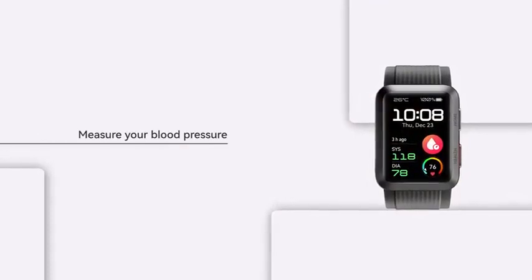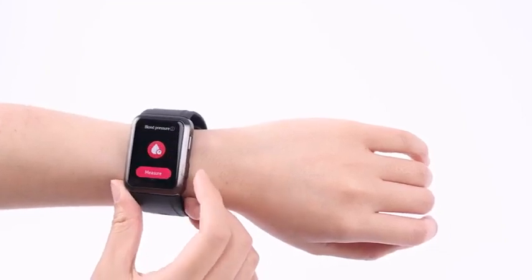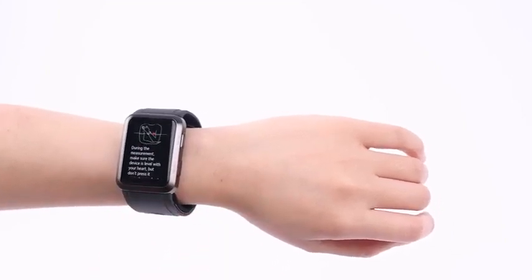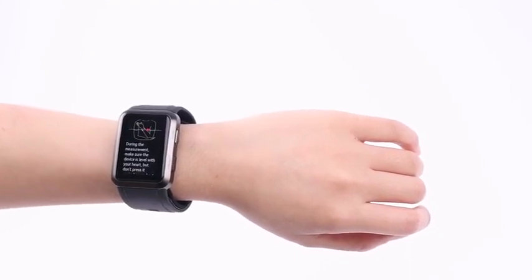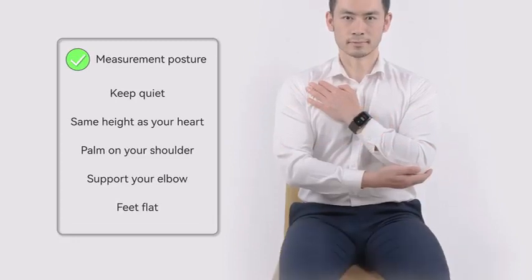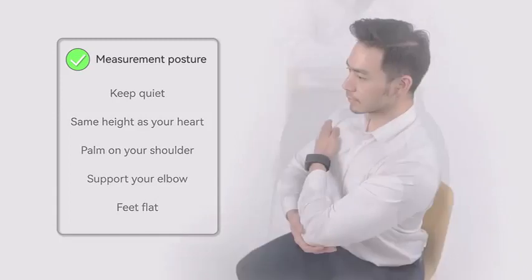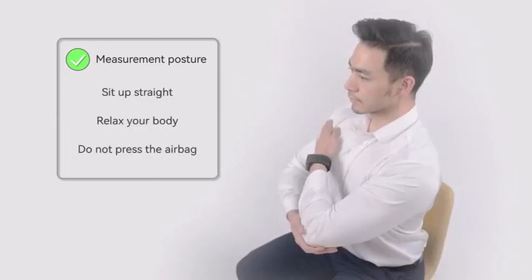Measure your blood pressure. Press the health button twice to start a blood pressure measurement. During a measurement, sit up straight, keep your feet flat on the floor and remain quiet. Raise your watch-wearing wrist to the same height as your heart. Gently put your palm on your shoulder and support your elbow using your other hand.